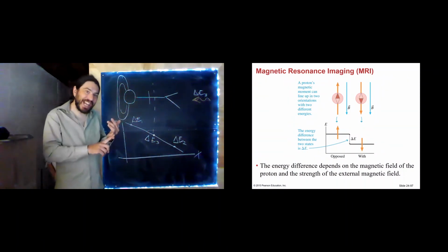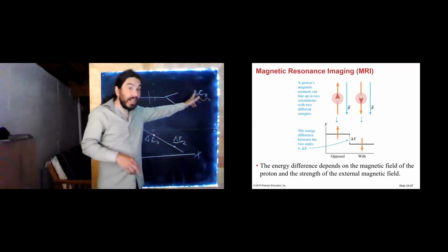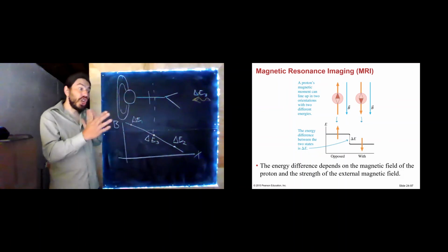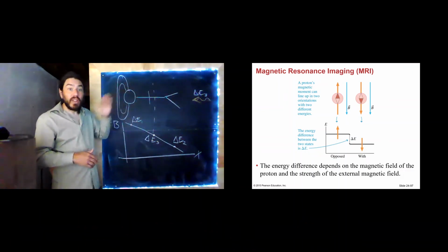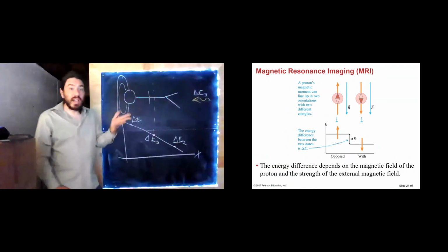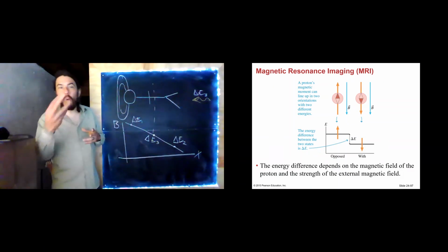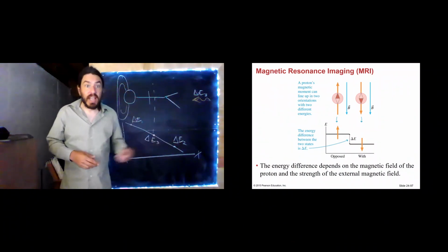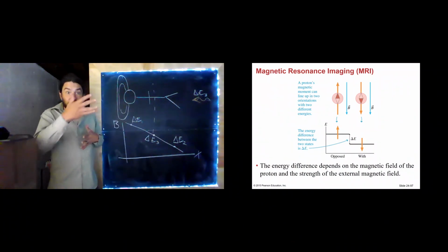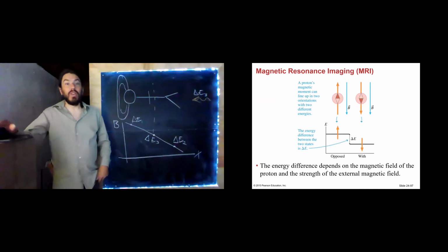But what we're getting is a shadow of the hydrogen atoms, and by tuning the frequency of this incoming field, we can adjust it so that we're getting an image of the protons in the hydrogen nuclei in the person's body at different places. Now, scientists know that heart tissue, for example, has a different water content than bone tissue does. And so they can distinguish between these different structures by looking at the absorption of the protons in the hydrogen, which, of course, H2O, water, our bodies are full of water.